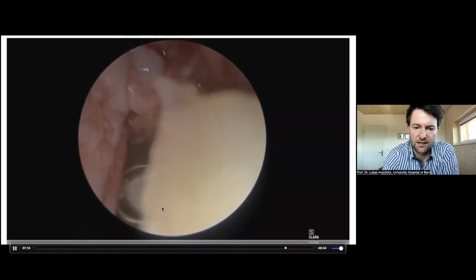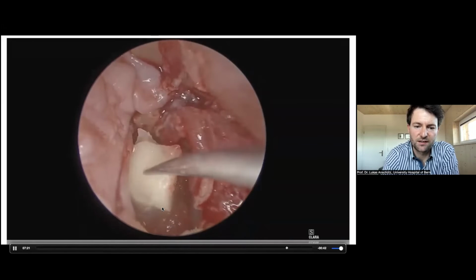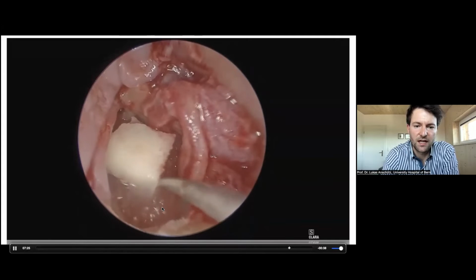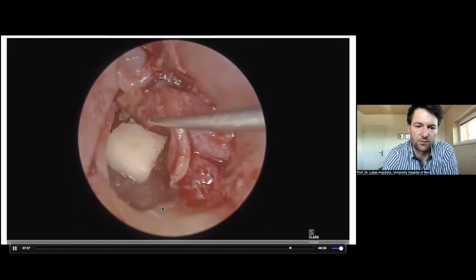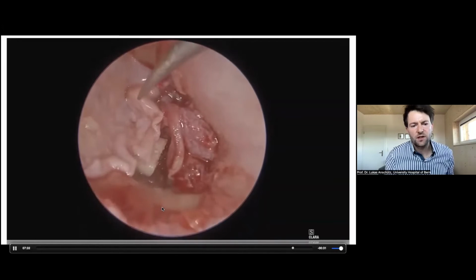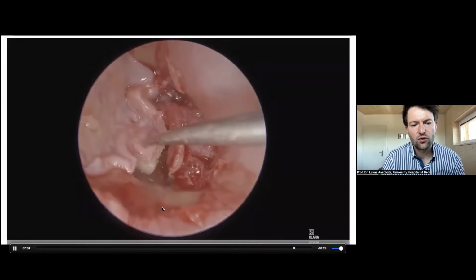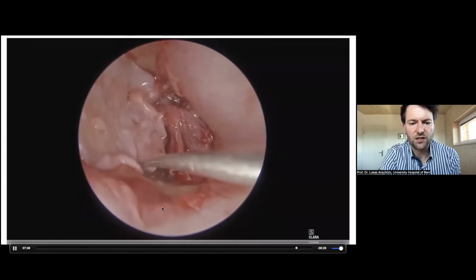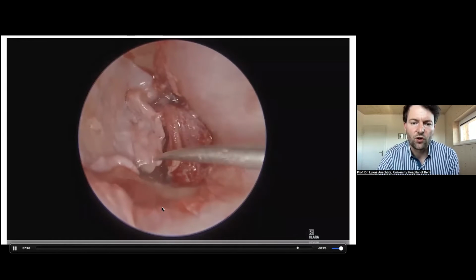Here I take away the cartilage from the needle with the endoscope itself, and then we can cover the prosthesis with the cartilage. I tend to use, especially in cholesteatoma cases, not so high a prosthesis and a thick piece of cartilage to avoid extrusion of the prosthesis.